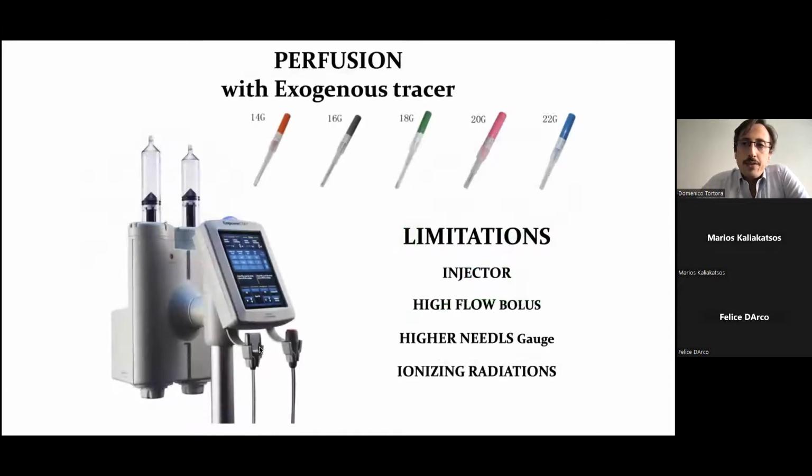The gold standard for the evaluation of brain perfusion, I'm speaking about the MR perfusion techniques, is still considered the dynamic susceptibility contrast, which requires the use of a bolus of gadolinium. In these techniques, we can estimate the parameters of brain perfusion during the passage of the bolus of gadolinium.